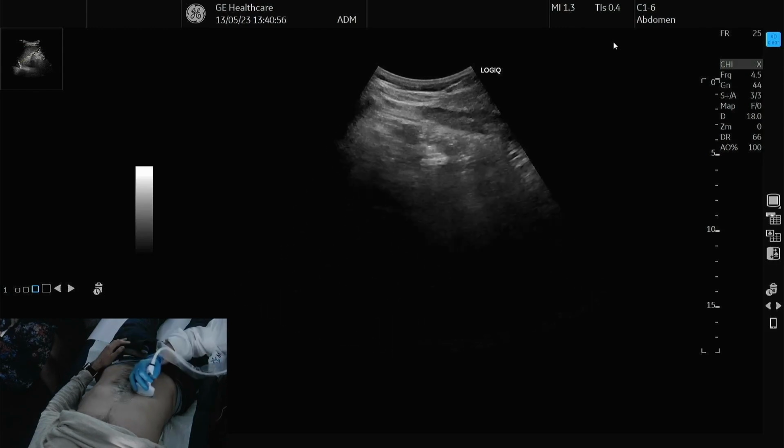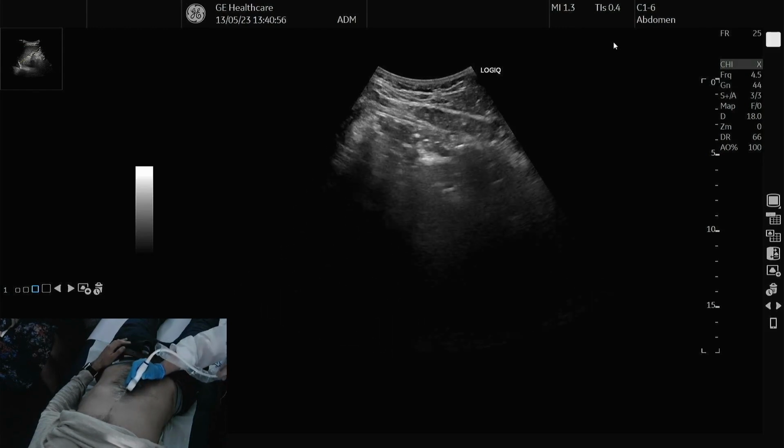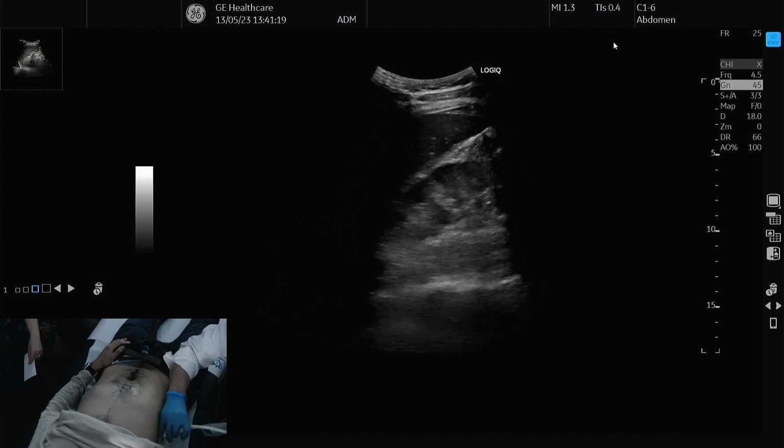Now why do I point out the orientational thing? Because the machine measures perfectly, so the distances that the equipment measures are non-negotiable, they are correct, but our hand never puts the measuring device in the same place. So we have an approximate measurement that we have to take into account, but obviously we have other landmarks to say whether we are dealing with organomegaly or not.